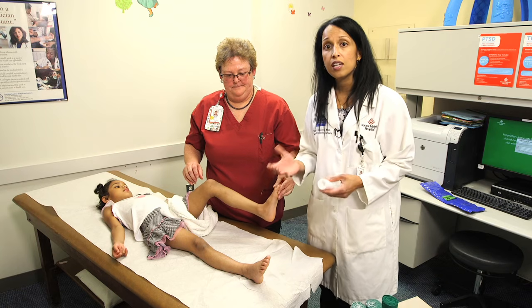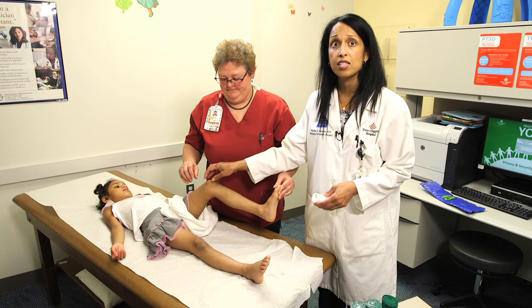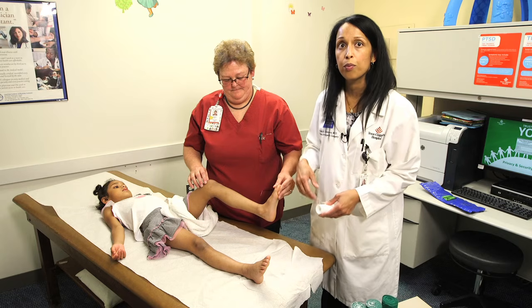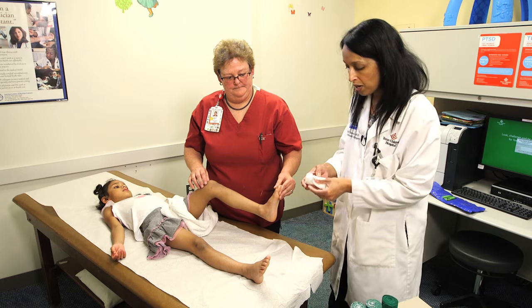When you splint an injured extremity, you want to splint with the lower extremity in a position of comfort, so the knee can be as flexed or extended as comfortable to the patient. But you do want the ankle at close to 90 degrees because that will prevent them from developing a pressure sore. Once you have the appropriate angle that you're going to splint in, you want to measure the patient.